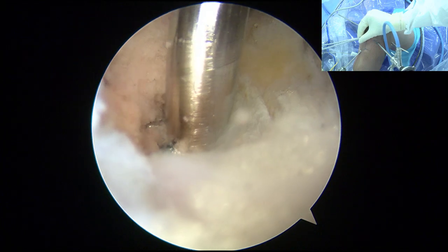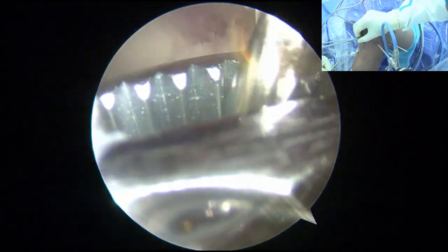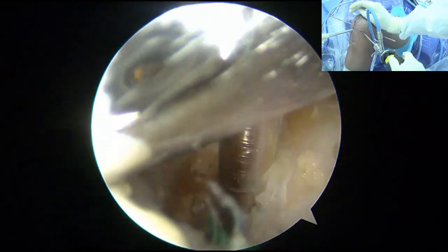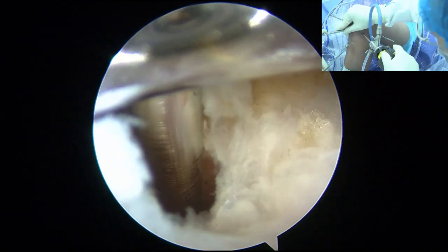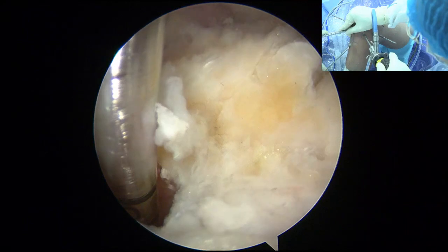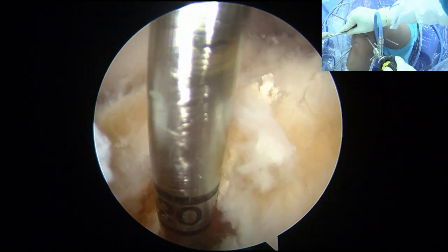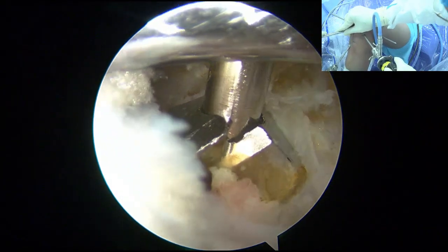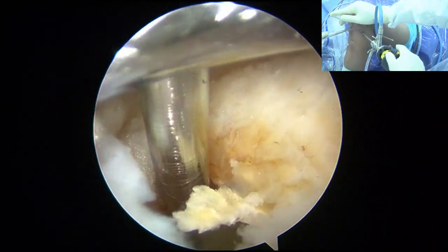Okay, here. You got it, right? Take it out. Okay, look at this. So you can change your tunnel now, right? Medial lateral, right? By controlling this one. If you want to go medial, you shift the center to the medial side, okay? So this is what Professor Adinan already mentioned in Arthroscopy Techniques many years ago. 我们几年前就在 Arthroscopy Techniques 里面发表了这个调整骨道朝向的方法。 Soft bone. Really soft bone. Okay, out.